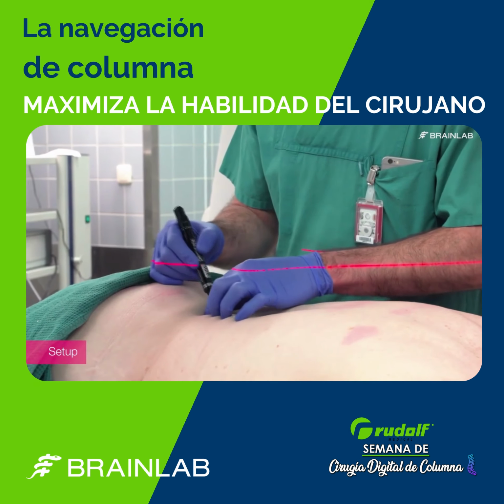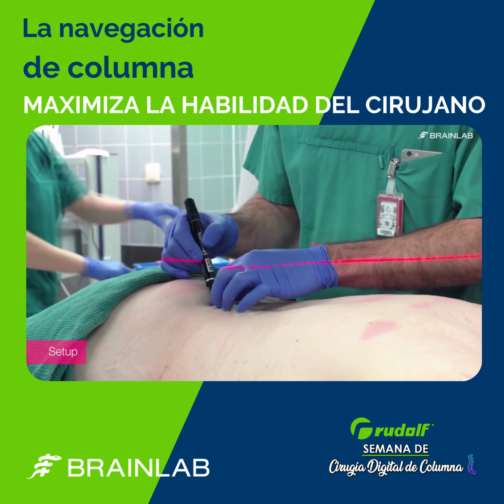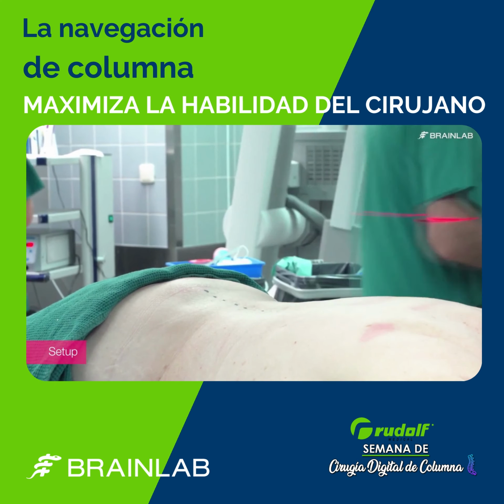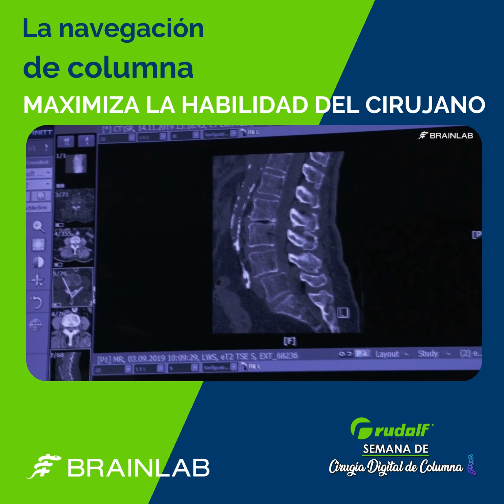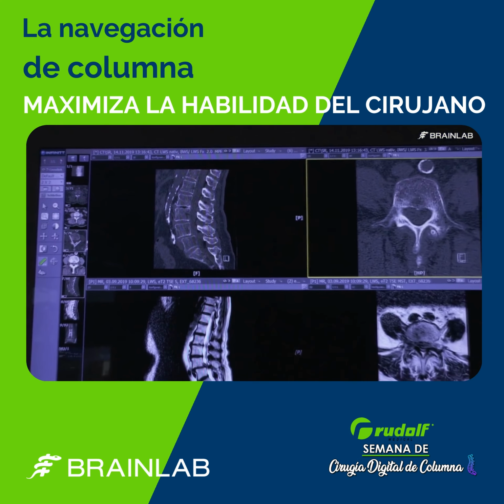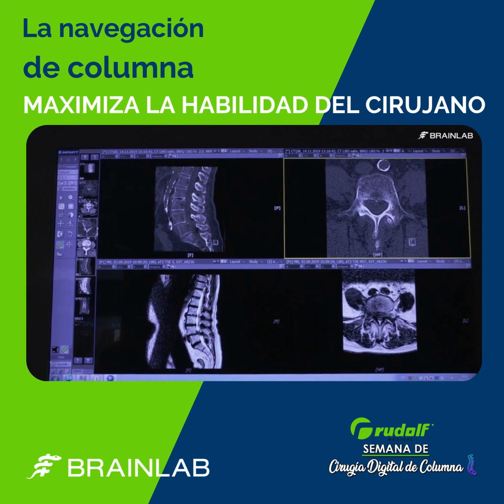This case involves an 82-year-old patient with back pain and claudication symptoms not responding to conservative treatment. MRI, X-ray and CT images show mobile spondylolisthesis L4-5 with relevant stenosis.